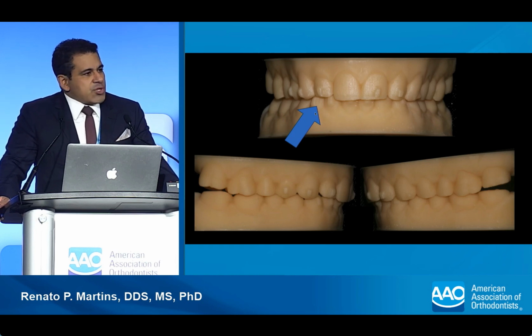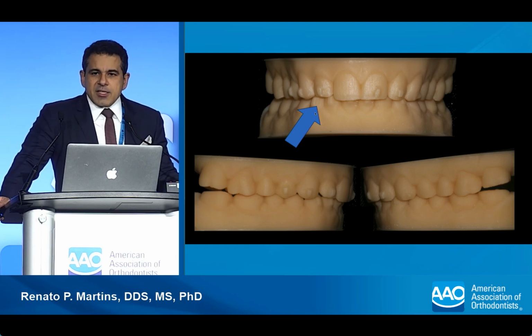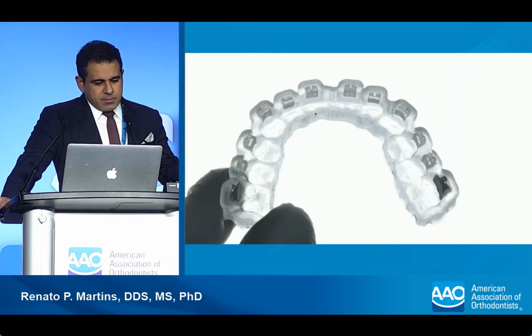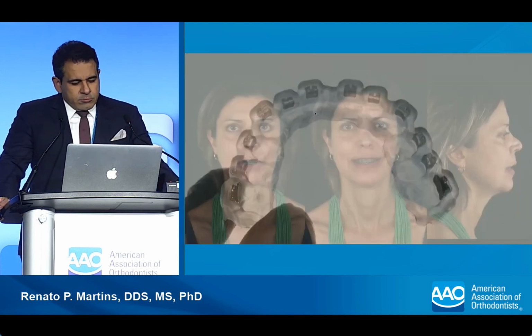And at this time in Brazil, one of the surgeons that I work with had not yet done surgery without brackets in aligner cases, so he asked me to bond brackets. So I used an indirect system. I bonded the brackets in the patient Friday, and she went to surgery Monday. So this was just a request of the surgeon. And this is her after 15 days.